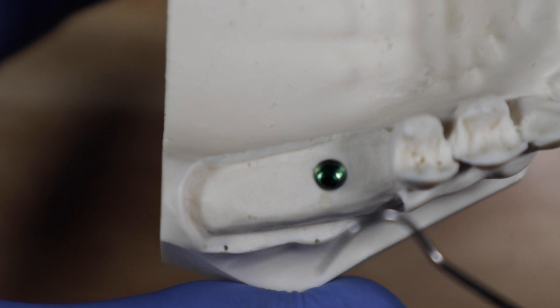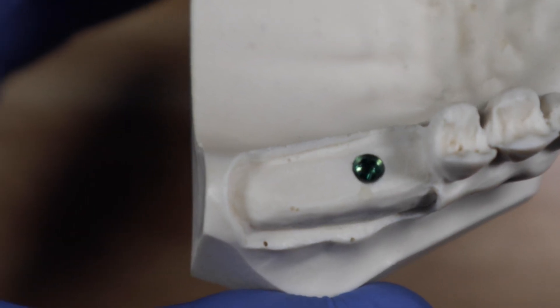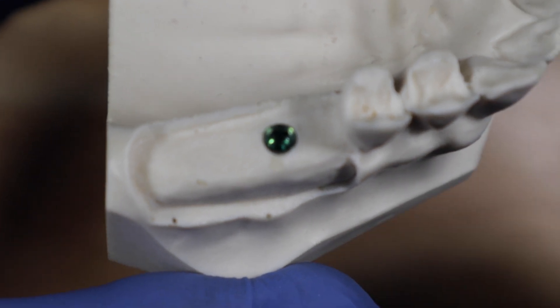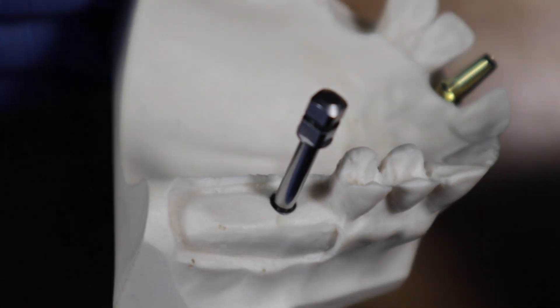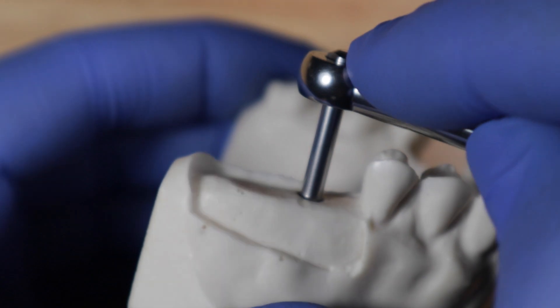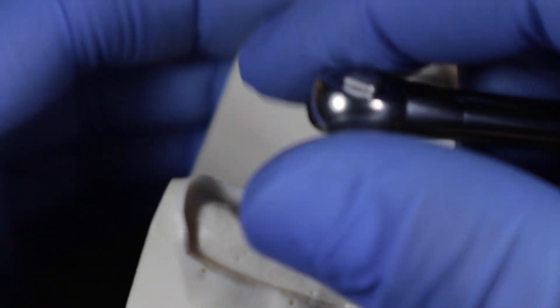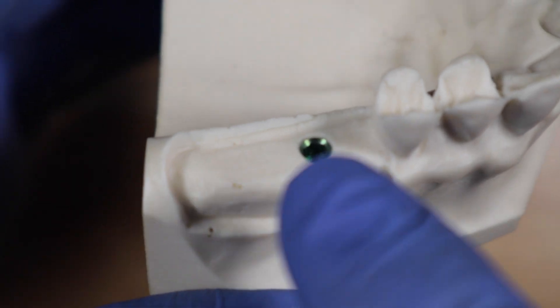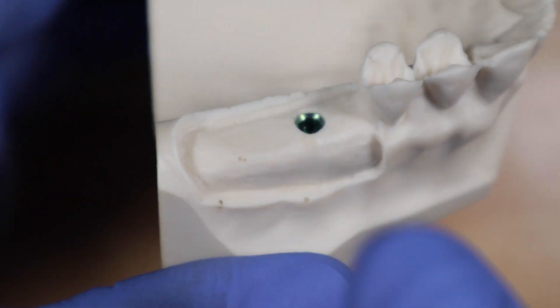So you actually want it to be below the bone one millimeter circumferentially. And if you still have to go a little bit deeper, you can get this guy from your surgical kit. So this will go onto your implant and you pop the wrench back on. And then you use that to sink your implant a little bit further so that's one millimeter deep. So now that it's one millimeter deep below the bone all the way around, now we can go ahead and put my healing abutment on there and call it a day.